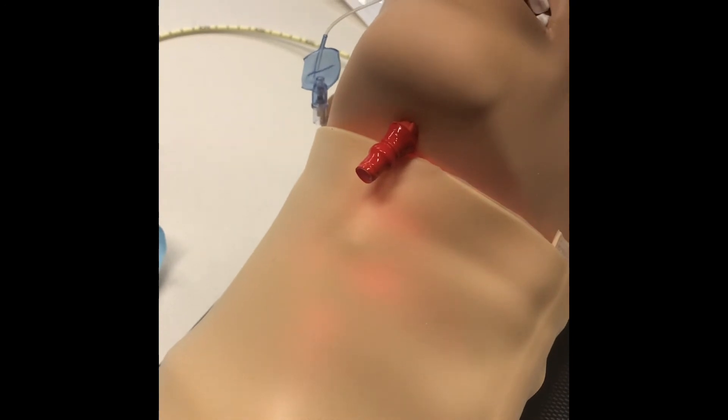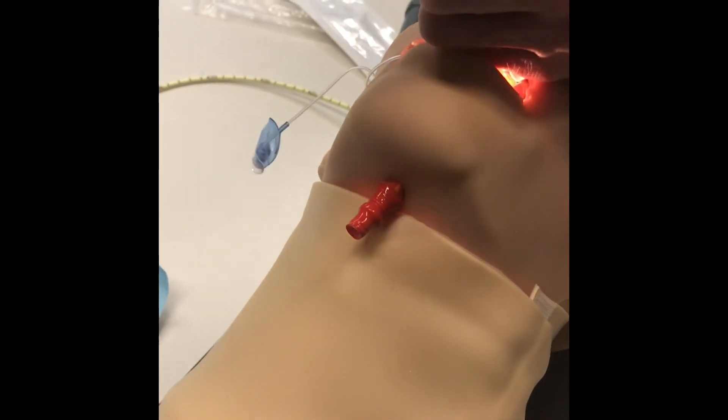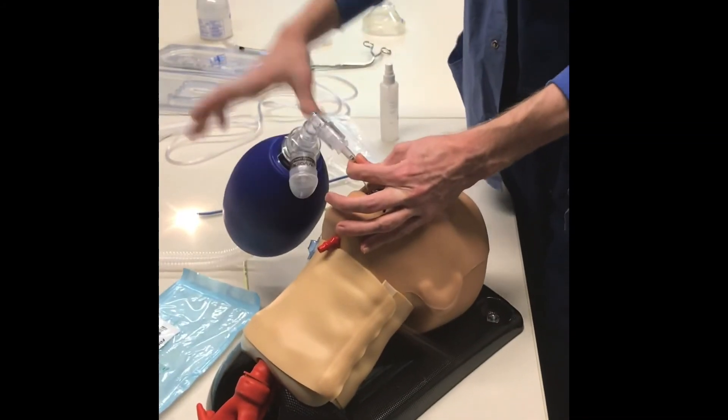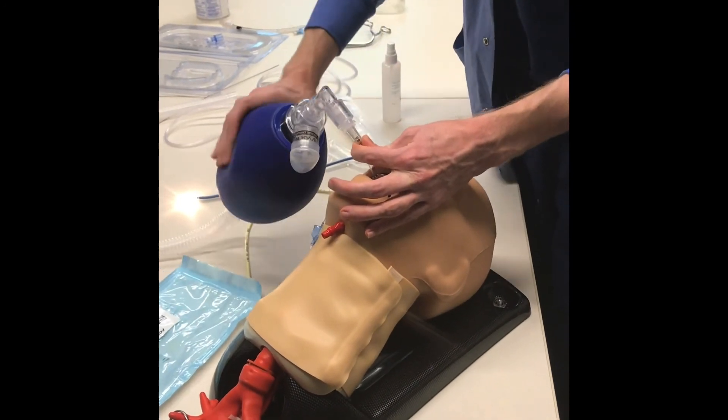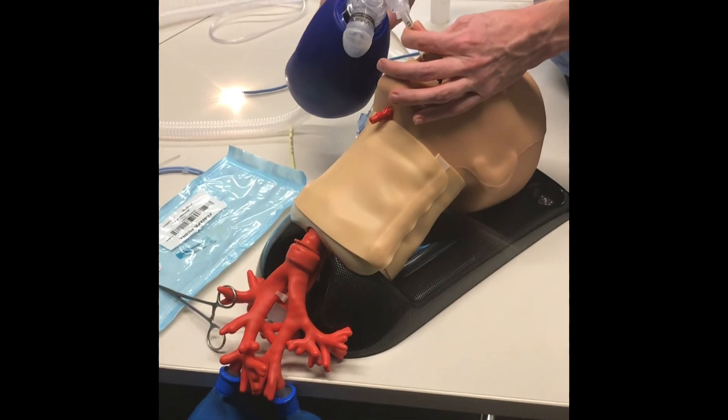We can then advance the tube and pull out the lighted stylet. Now that we have the endotracheal tube in place and the lighted stylet out, we can ventilate our patient as we would.